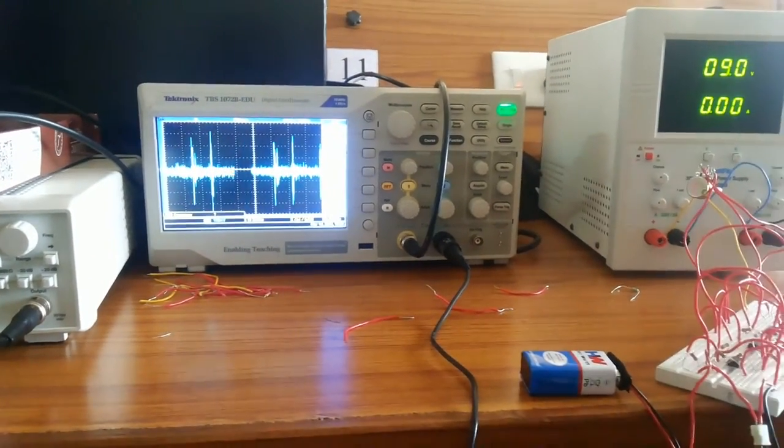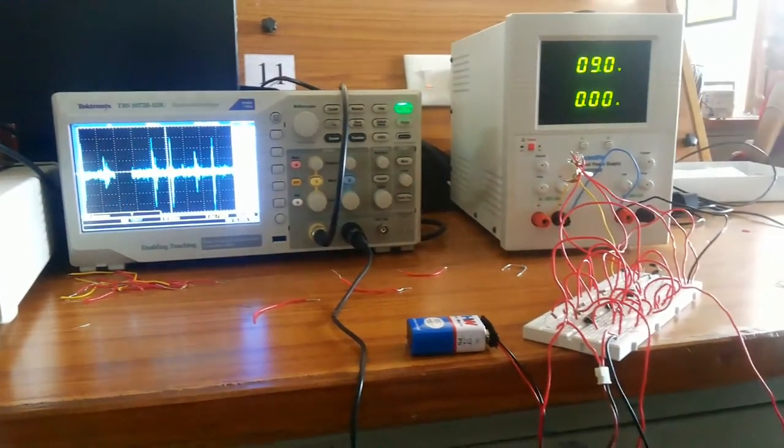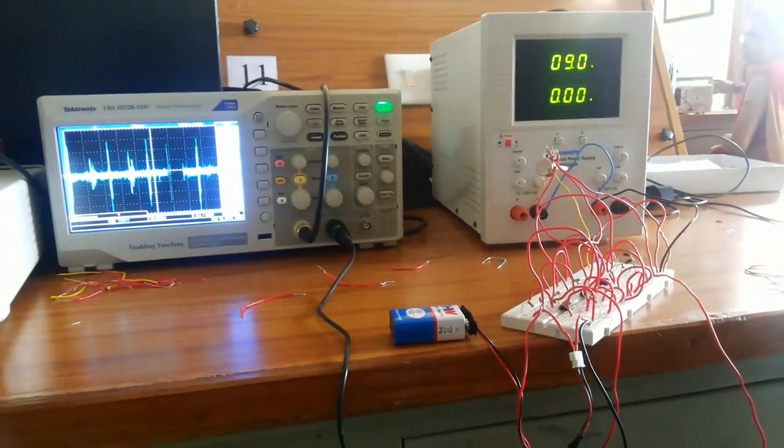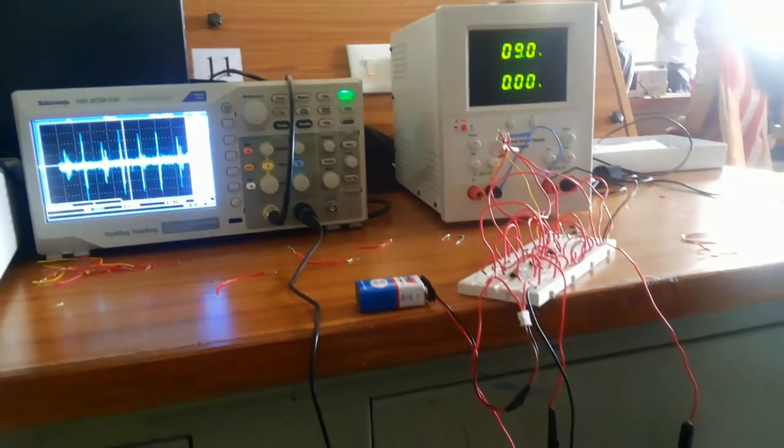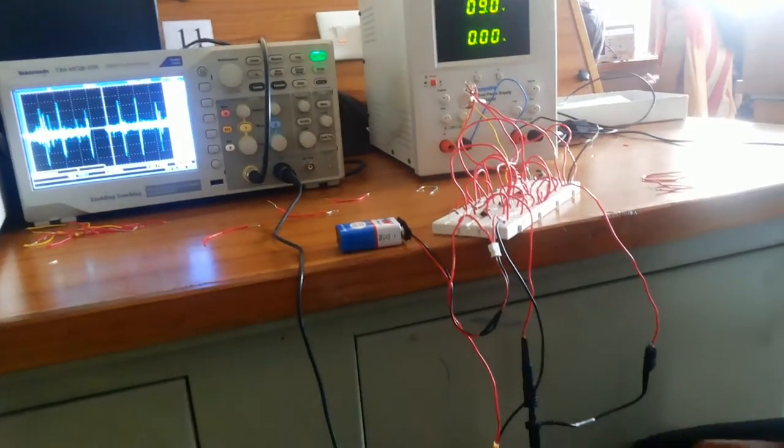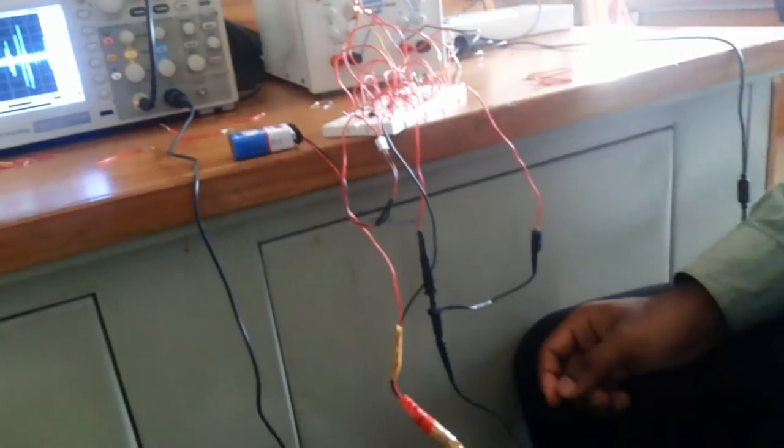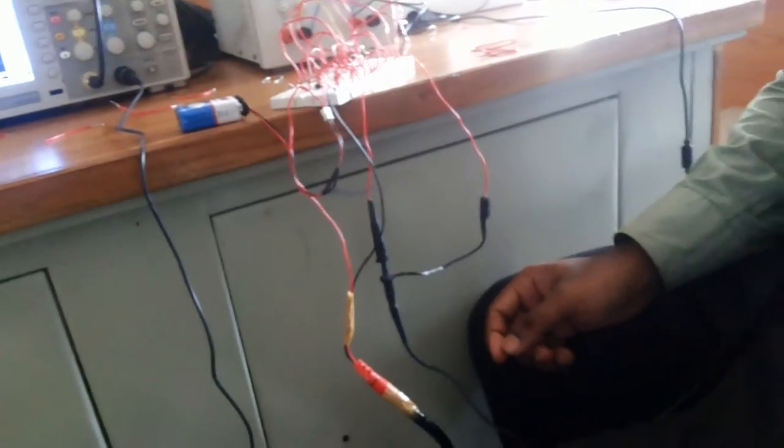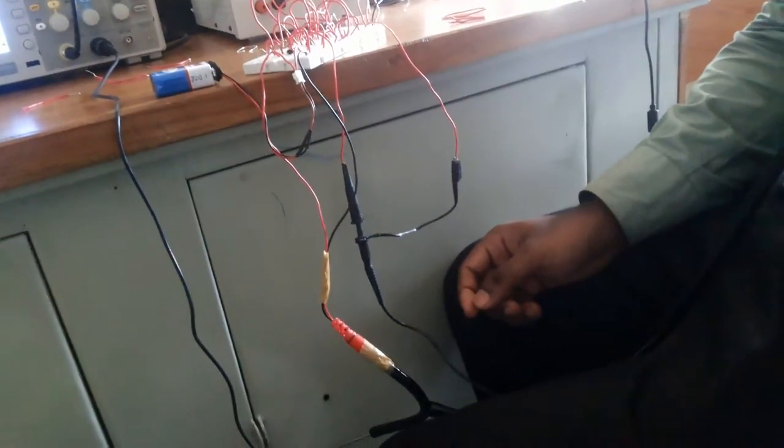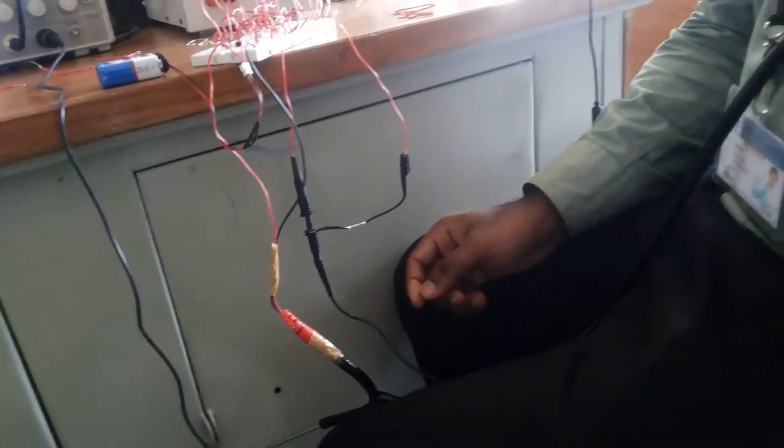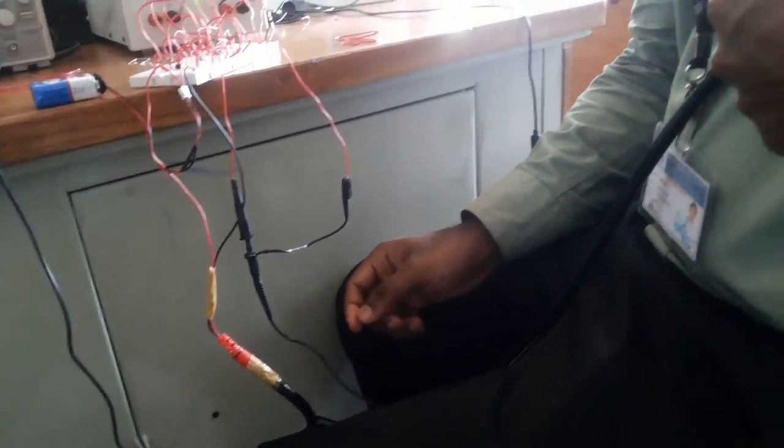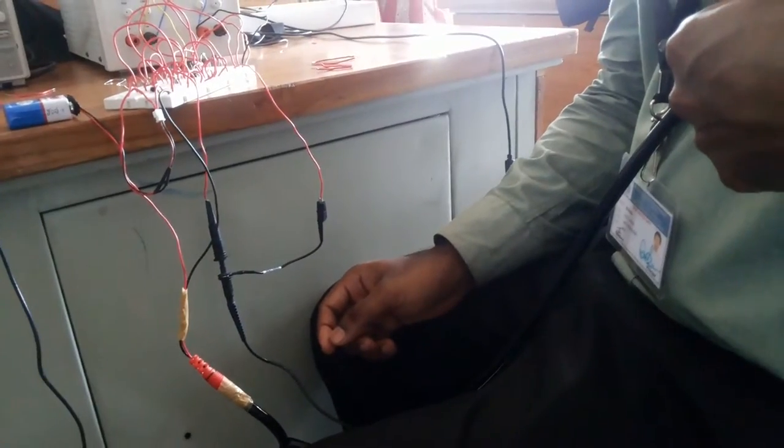In first step, the pre-amplifier amplifies the signal acquired from the microphone. Then the amplified signal is fed to the low-pass filter with cut-off frequency of 500 Hz to remove the ambient noise signals.